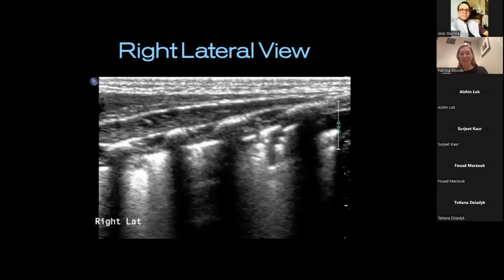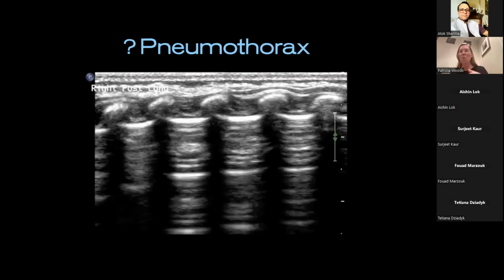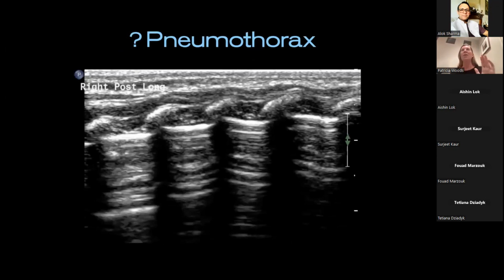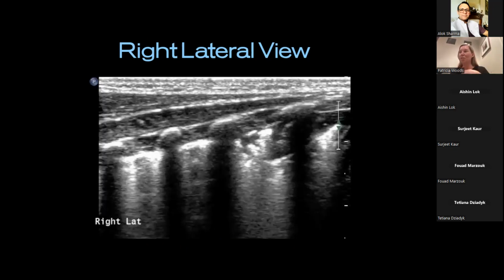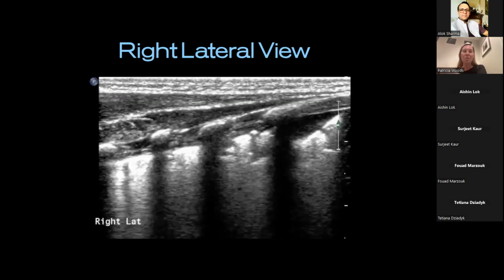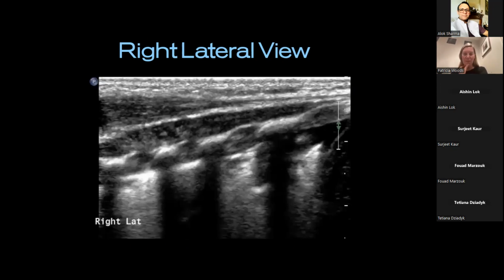And if you come back to it and then look at that, that's different. Okay, when it is really hard is when it looks like that everywhere to start with. Okay, can be more in keeping with the hyperinflation and things. So using areas of contrast. So in reality, I would ask you, don't put your probe exactly where you think immediately the air leak is there. Do yourself a favor, 2 seconds, stick it somewhere else, the other side if you have to, and go, yeah, this is what this baby's lungs look like, or the lung artifacts that the pleural surface looks like. Okay, so it can help you a little bit.